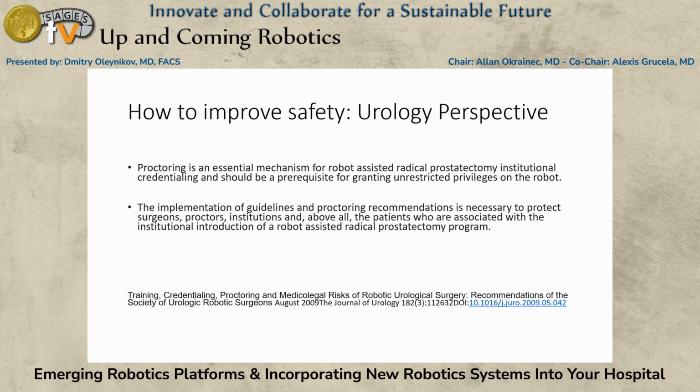So what does the Urology AUA Society tell us? They've had a lot of experience with robotics, as I'm sure everybody remembers. They were one of the first to adopt that in the United States. What they say is that they think proctoring is an essential mechanism for robot-assisted radical prostatectomy, for credentialing, and as a prerequisite for granting unrestricted privileges. So what they're basically saying is, if you want to do a robotic prostatectomy, you better get an expert to come help you. Then the second thing they say is the implementation of guidelines for proctoring recommendations is necessary to protect surgeons, proctors, institutions, and of course, above all, patients.